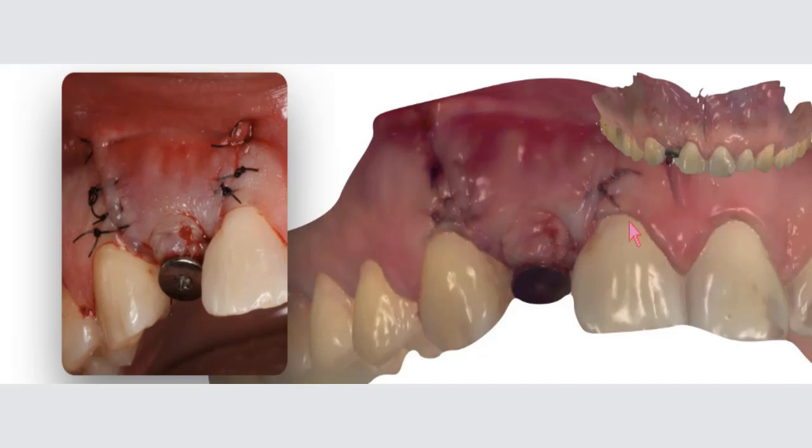See, is scanning the beginning. Then you can maybe scan the patient during the treatment. That's the message I want to give to you. So you scan it during the treatment. And then you're going to scan, as in this case, as the healing process goes. And then you scan when the restoration is finished. Doesn't take that long. Just gives you more security for the process you're doing.